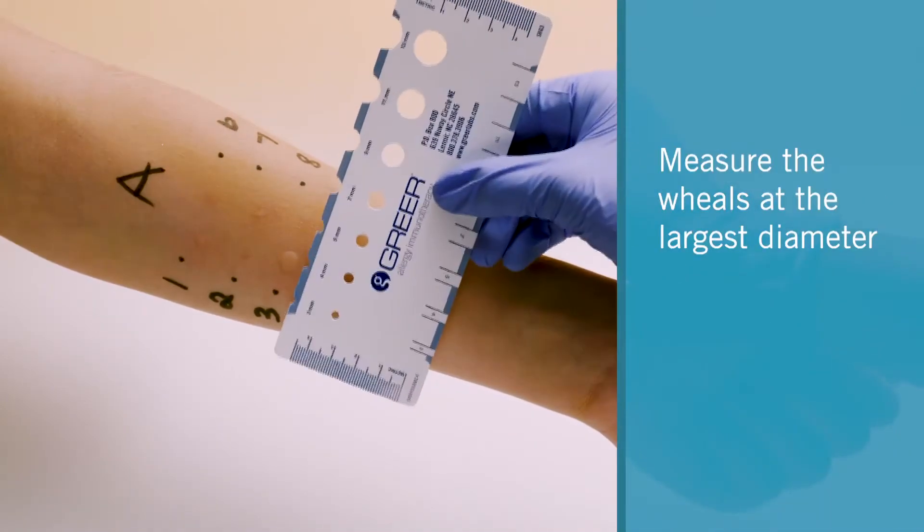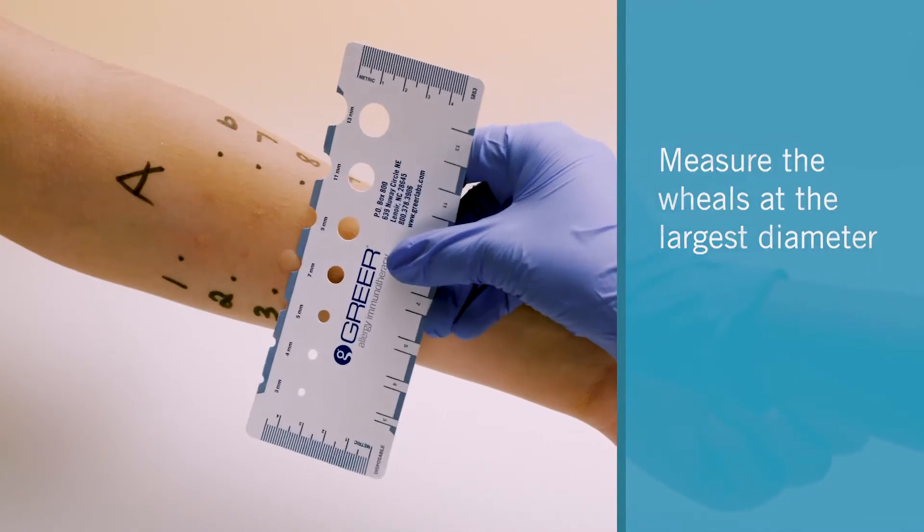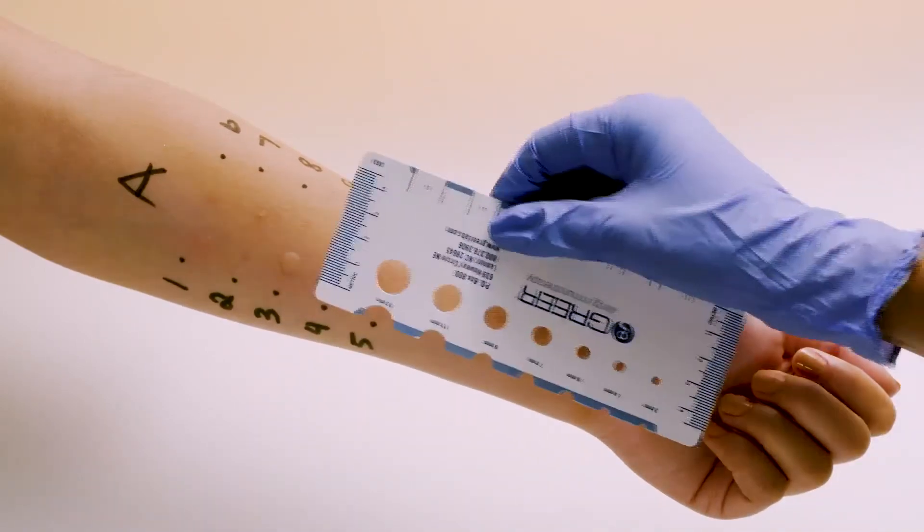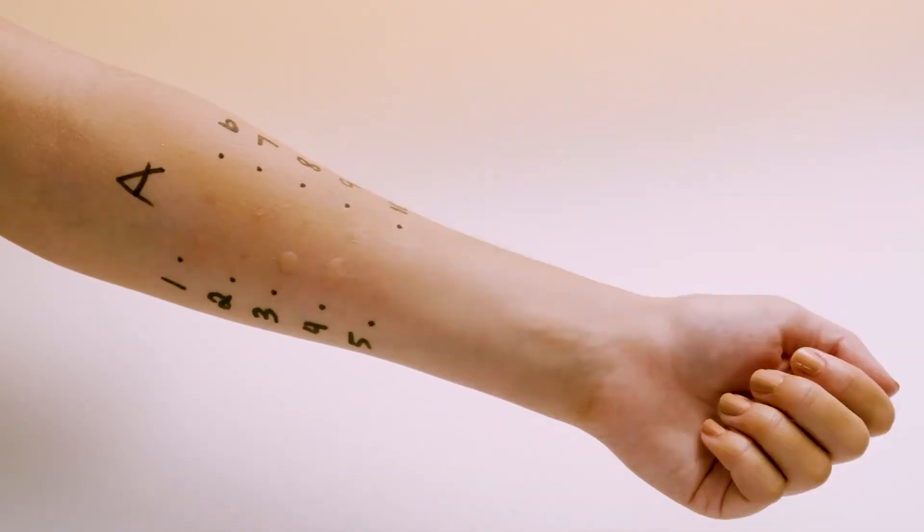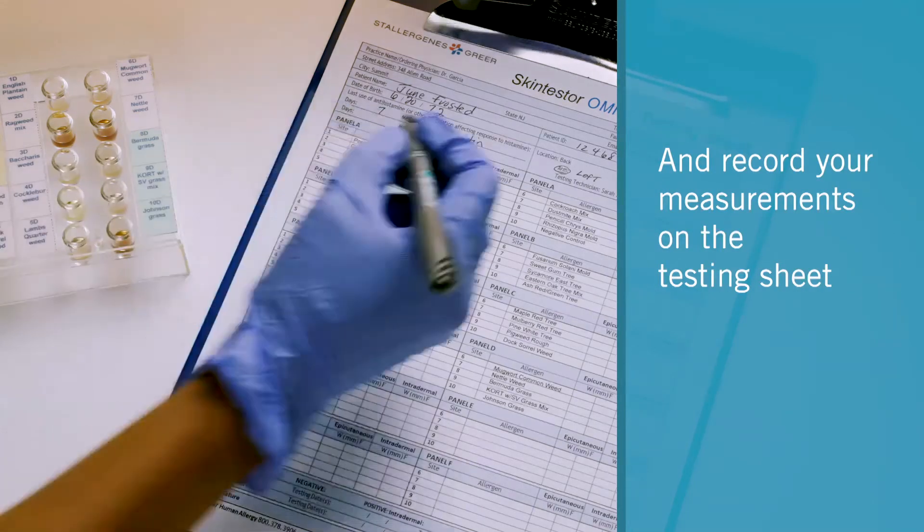Measure the wheals at the largest diameter and record your measurements on the testing sheet.